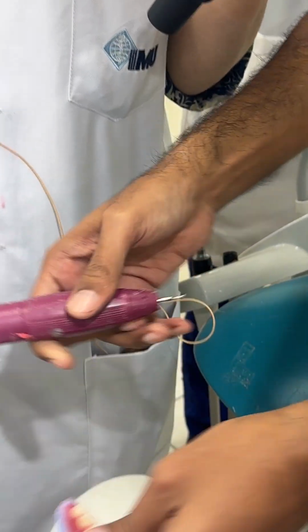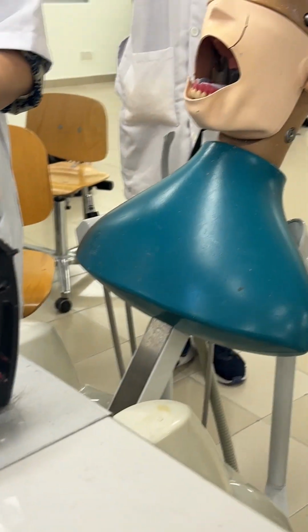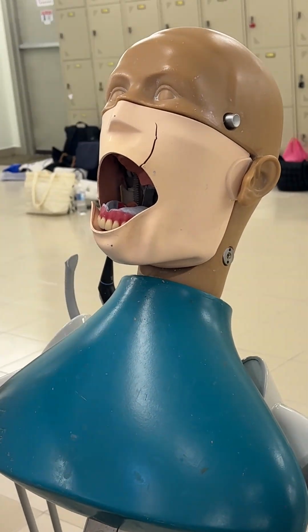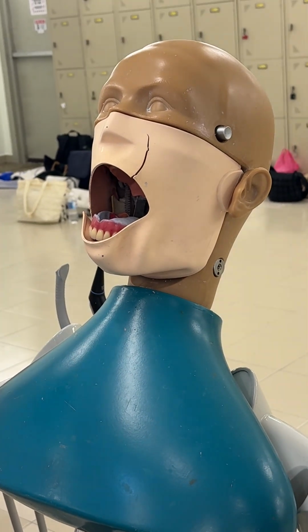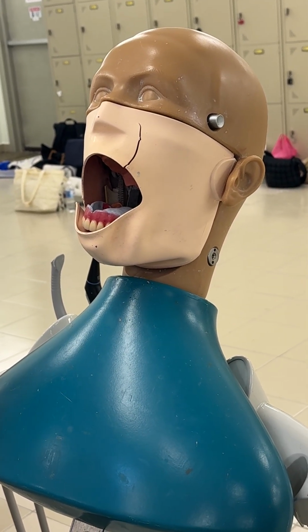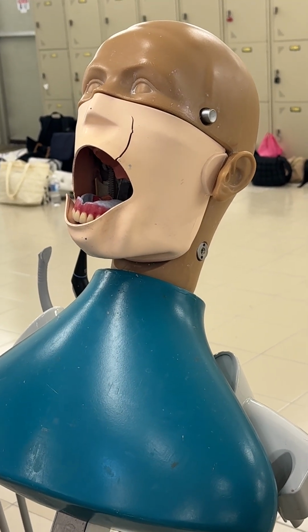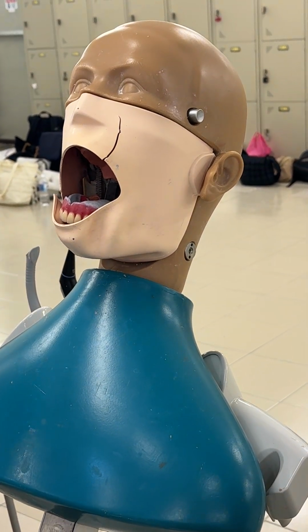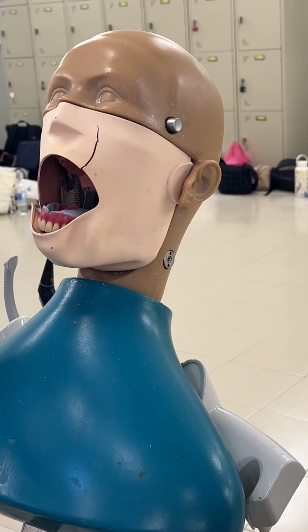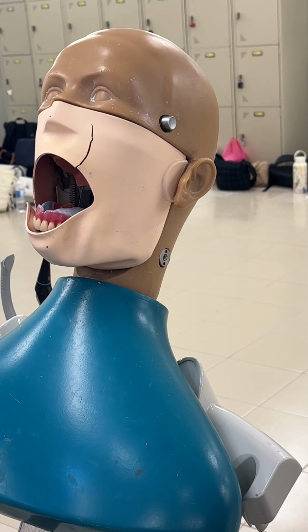Just remember one thing, sorry. Whenever you are trimming the tooth for adjustment of the occlusion, don't make any cusp or any anatomy flat. You always follow the curve and miniature of the tooth. You have to maintain the anatomy of the tooth. You may reduce it, but you have to follow the anatomy of the tooth. If you are reducing it in a flat manner, you lose the occlusion, so the patient will not be able to chew or grind the food.